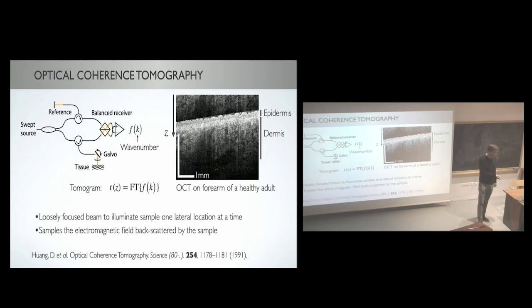Now, is this finally working? All right. So, optical coherence tomography, Matthias mentioned it briefly yesterday. It just celebrated its 30th birthday a while ago. Many of you probably have already had an OCT scan of your retina. That's really the main application of OCT. It's now used routinely in ophthalmology or even by optometrists.